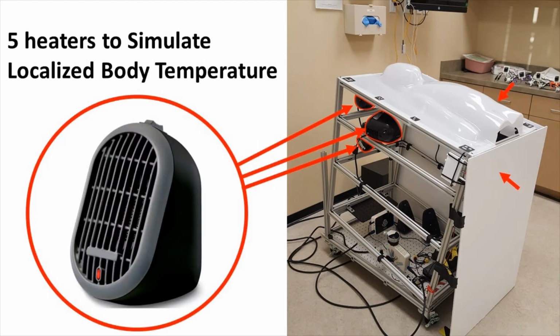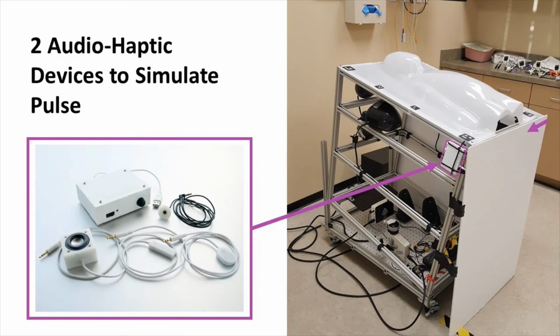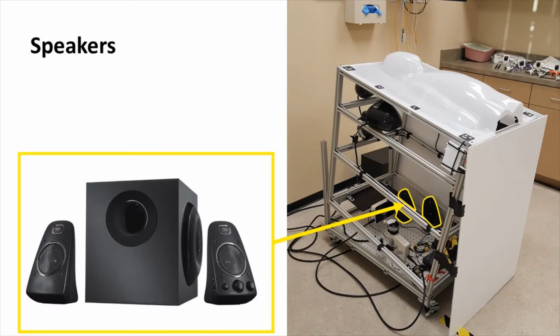5 personal heaters are positioned at different body parts to simulate localized body temperature. For example, the head can feel warmer to touch than the hands. 2 audio haptic devices simulate pulses from under the shell. A speaker outputs the patient's speech.